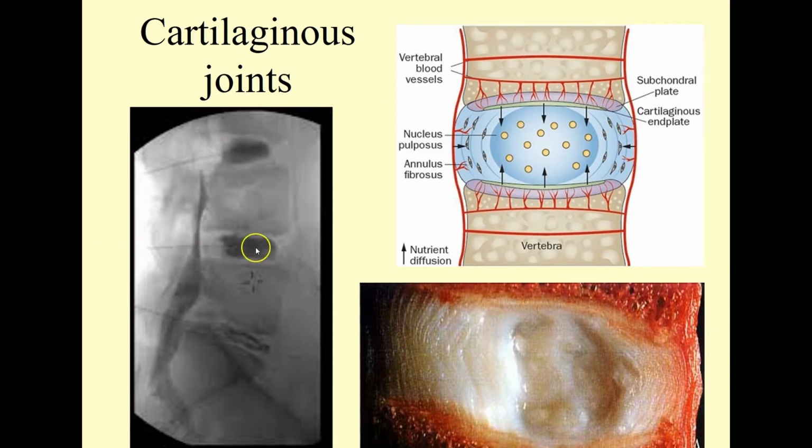Again, you can see the needle track. Again, put the needle in the center of the disc, and a little less well contained, implying that there is some circumferential and/or radial tears that are reducing the integrity of the container. And then here we are down here at L5-S1. Again, you can see the needle track. They inserted the contrast, and it's just all over the place and getting very close to emerging outside the annular fibers. So again, discogram, very normal looking, on its way to pathology, very pathologic presentation in a fluoroscopic image.